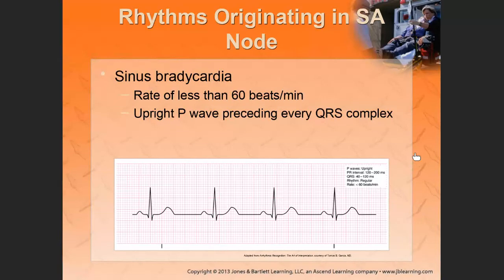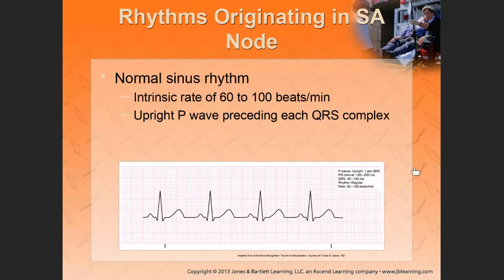All right, now let's look at this one. Now, can you see P waves and is it consistent? Oh, there's something I didn't point out before I move forward. You also need to check to see if the rhythm is regular or irregular.